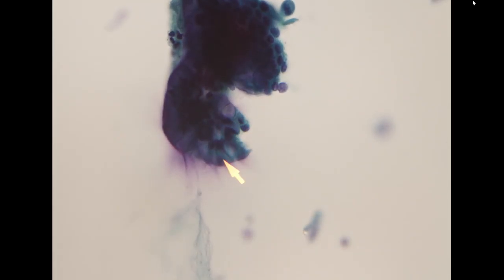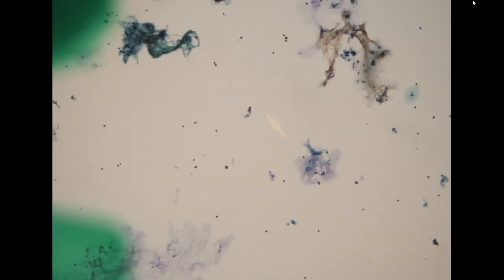Additionally, you see abnormal mucinous differentiation, mucinous-like cytoplasmic mucin. This is abnormal, and it is getting a little bit orangeophilic. So this looks like well-differentiated mucinous adenocarcinoma. If this is the only gland, it will be really difficult to make a definite diagnosis.